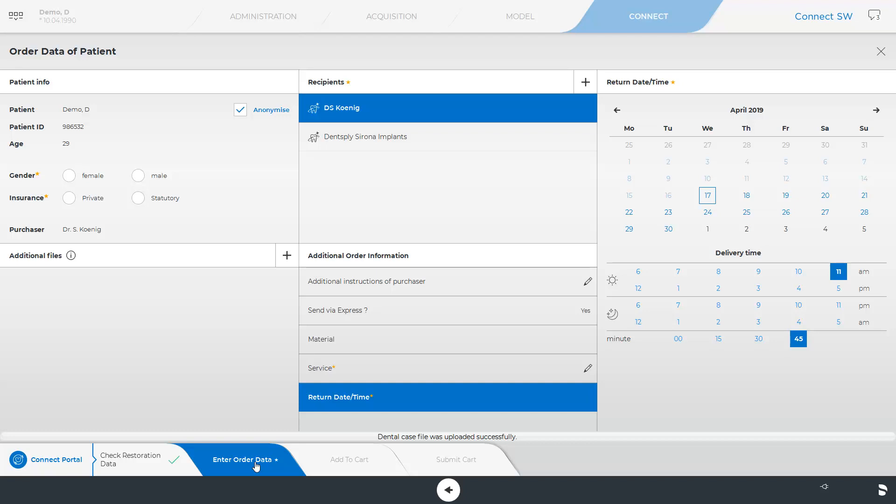The order data to be determined may differ from lab partner to lab partner, as laboratories can individualize their digital order sheet in their ConnectCase Center customer account. The order sheets need to be completed by the dentist before sending the case. Fields marked with an orange asterisk are obligatory fields. A check mark placed in the field Anonymize ensures that only an order number for this case is forwarded, without any patient data. Next, we will go through all specifications in order to eventually send the case.